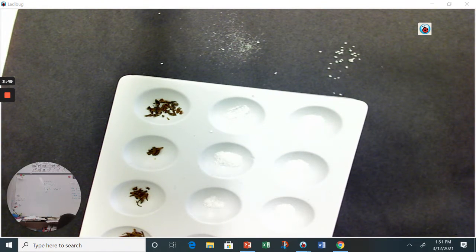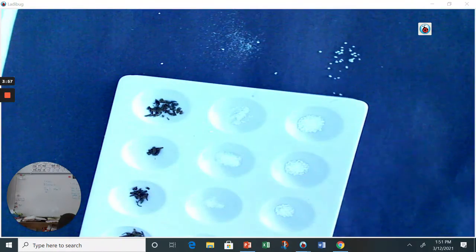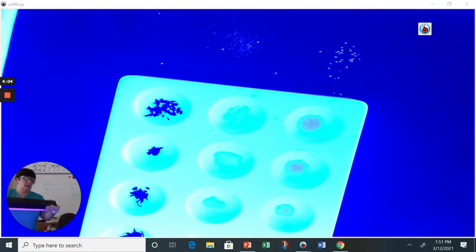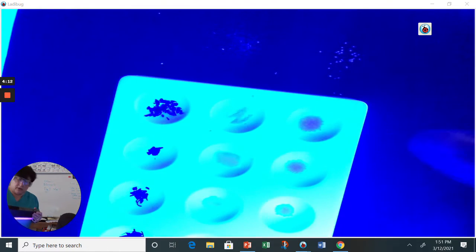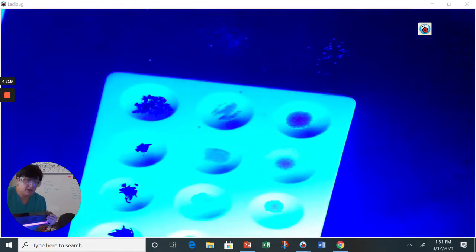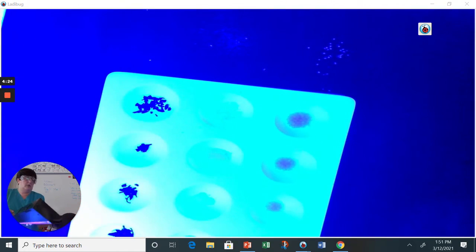I'm going to have to turn off the lights. I hope it's dark enough. When I bring the black light over for you to see, so I'm going to bring the black light over. Now this might get kind of difficult. Now if this is very dark, that means that it's not fluorescing, it's not giving off a bright light. It turns a dark purplish color. There is no color variation on your marijuana.